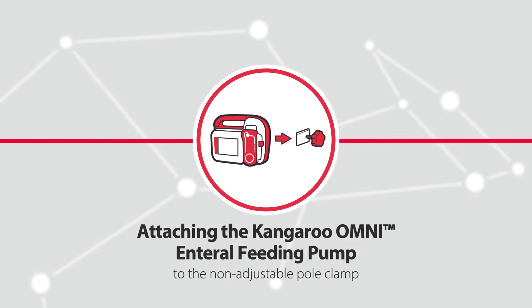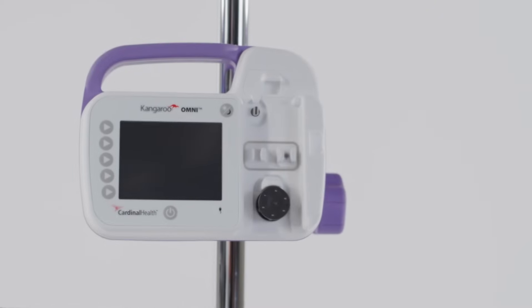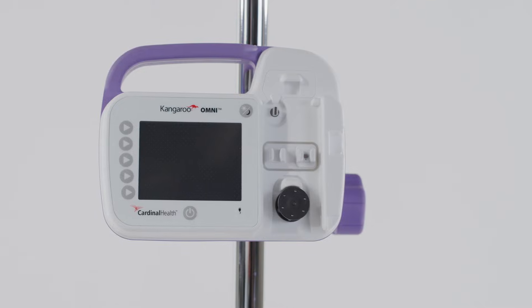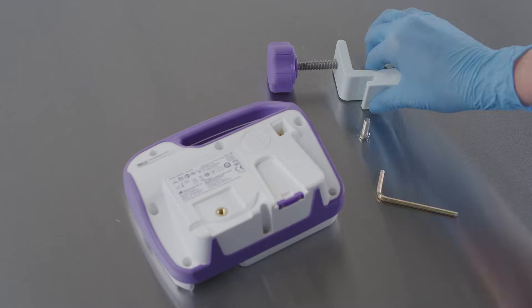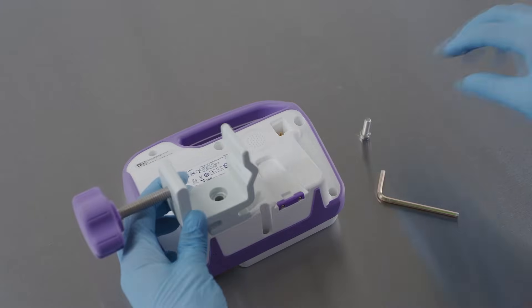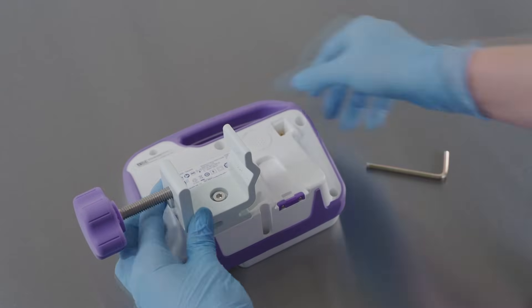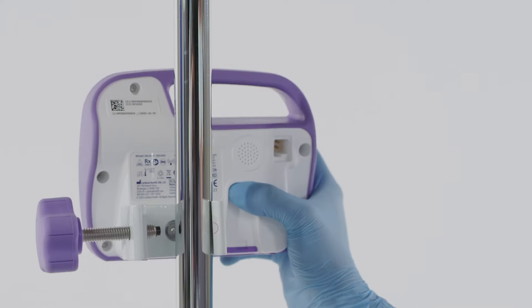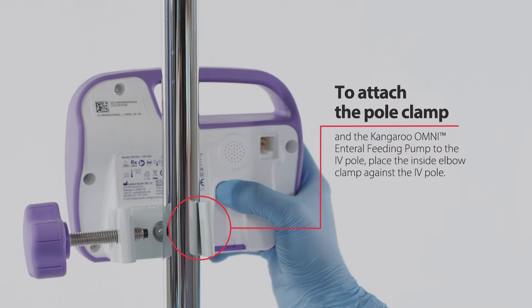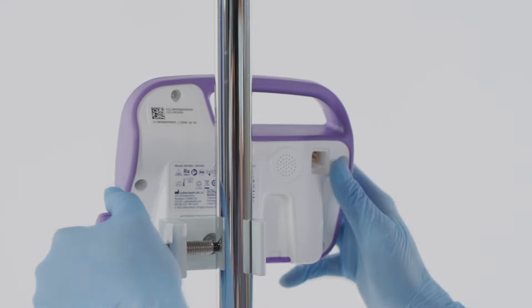Attaching the Kangaroo Omni enteral feeding pump to the pole clamp provided with the pump. The pump can be attached to a pole in a horizontal or vertical position using the included pole clamp. Using the screw provided, attach the pole clamp to the back of the pump and be sure to tighten the screw. To attach to the IV pole, place the inside elbow clamp against the pole and tighten the knob so the pump does not slide down.